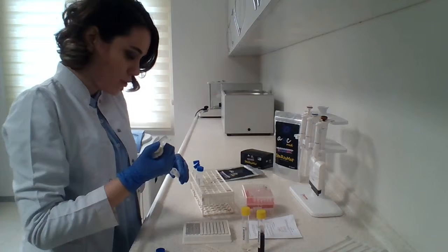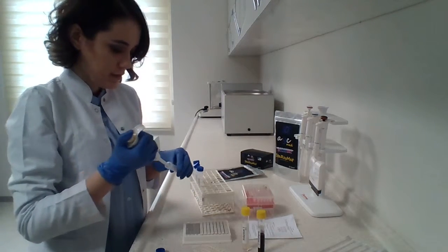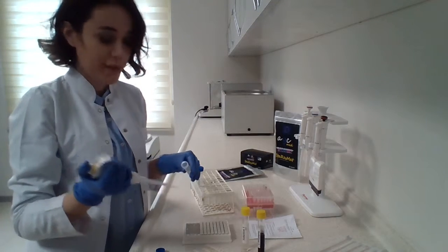In this part, we're going to use each strip as one bacterial test. So each strip can be used for one patient.